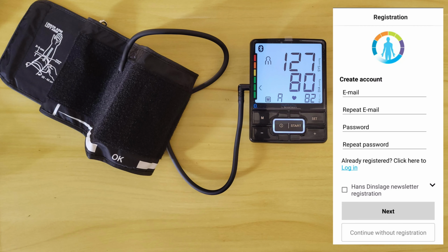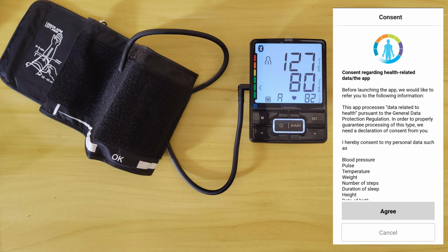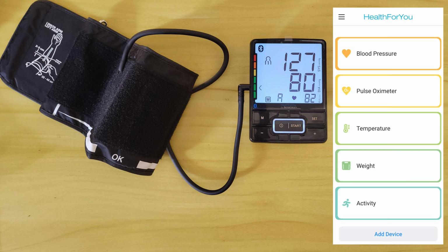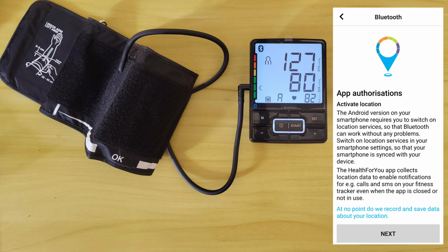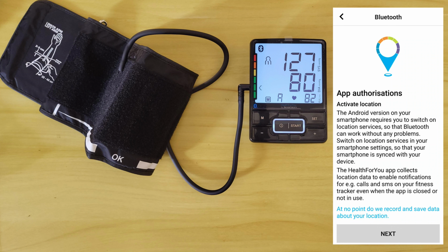Now, I have downloaded the HealthForYou app. Install it, create an account if you want, or continue without registration. Agree. Personal information. You need to add some of your personal information. Let's get started. Add a device. Blood pressure monitor, the SBM 69. Next, we're using the app.